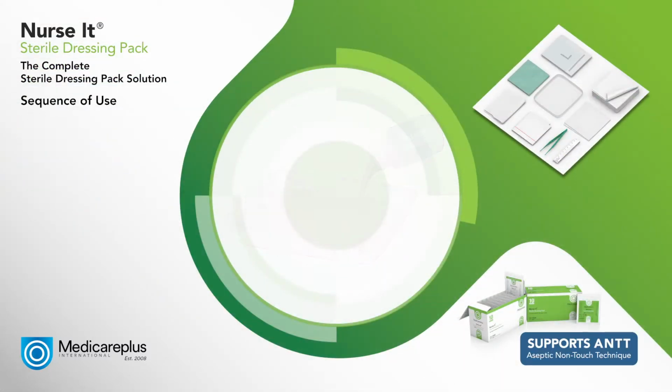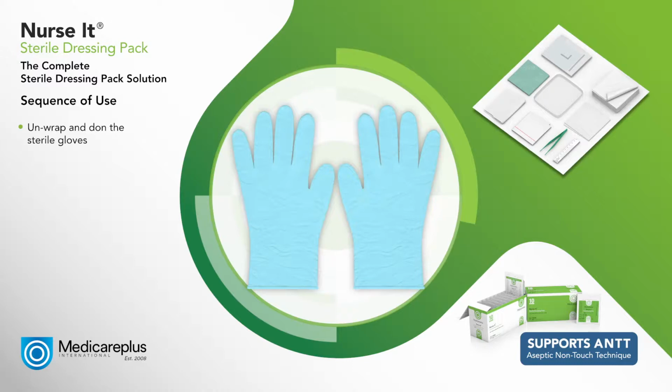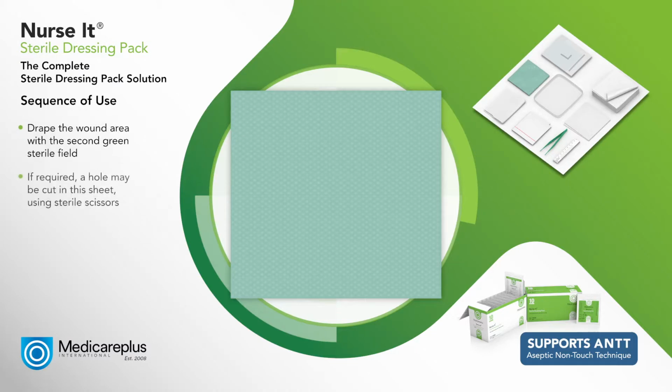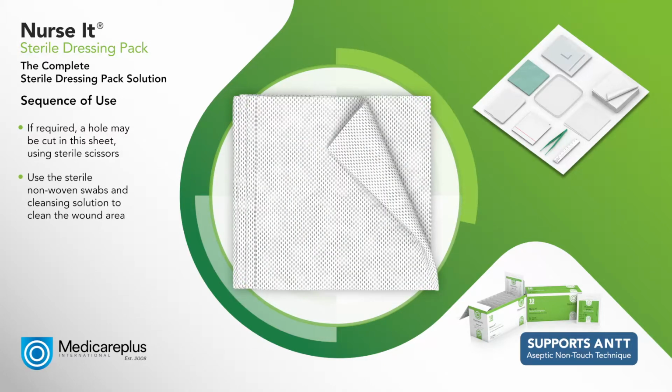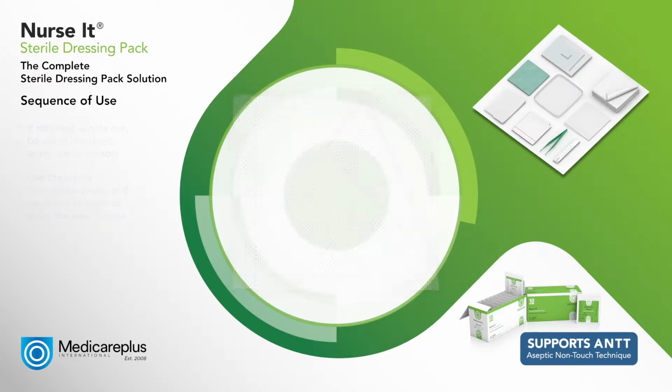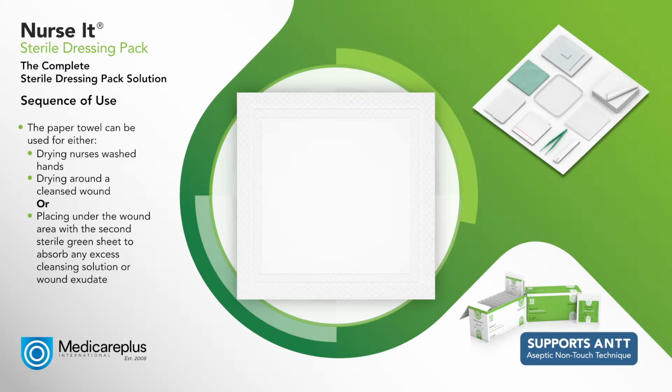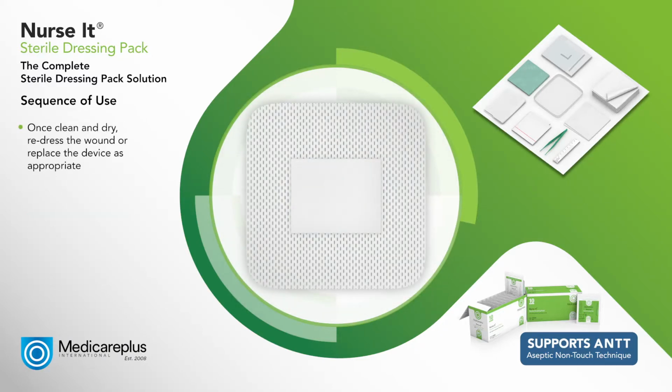Now unwrap and don the sterile gloves. You may now choose to drape the wound area with a second green sterile field. If required, a hole may be cut in this sheet using sterile scissors. Next, use the sterile non-woven swabs and your pre-prepared cleansing solution to clean the wound area. The paper towel can be used for either drying nurses' washed hands, for drying around a cleansed wound, or for placing under the wound area with the second sterile green sheet as an extra sheet to absorb any excess cleansing solution or wound exudate.